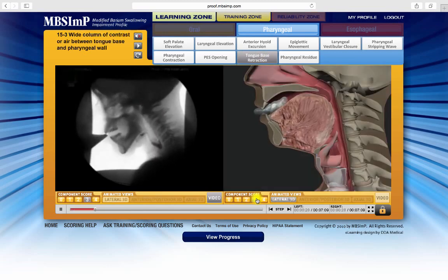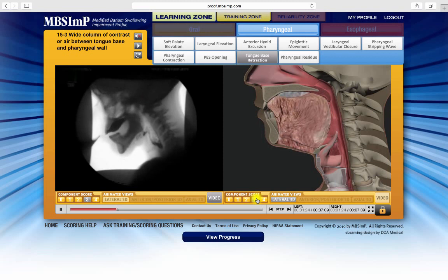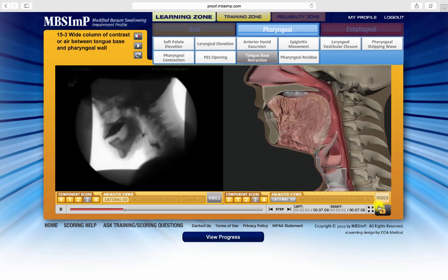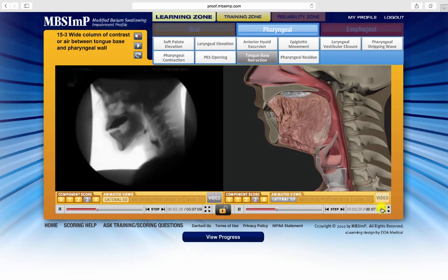At any time, clicking the locked icon, now on the right side of the screen, returns to the unlocked mode.